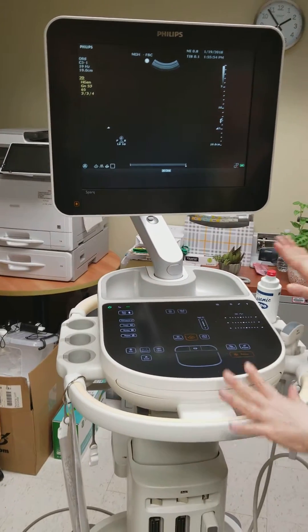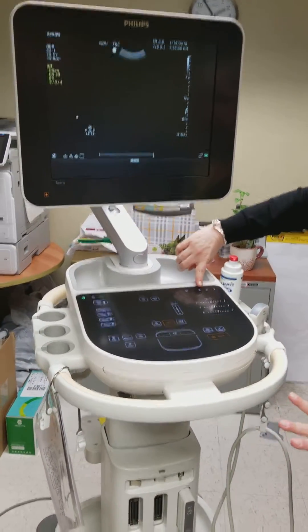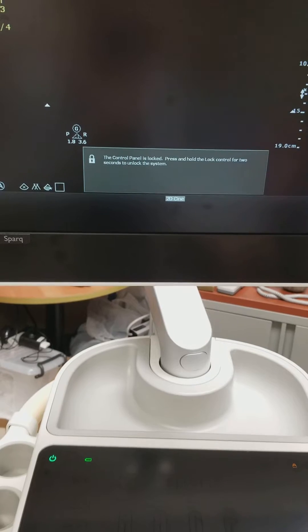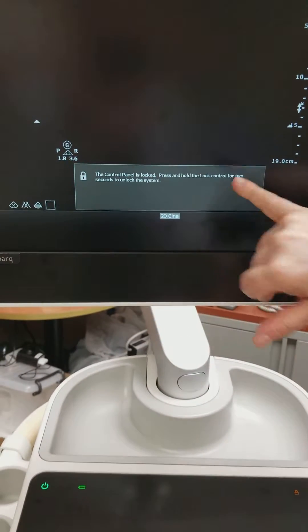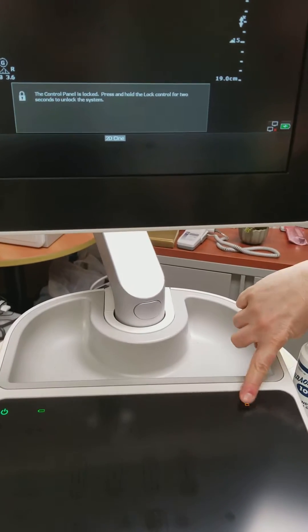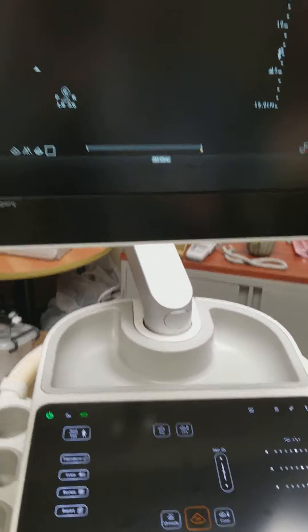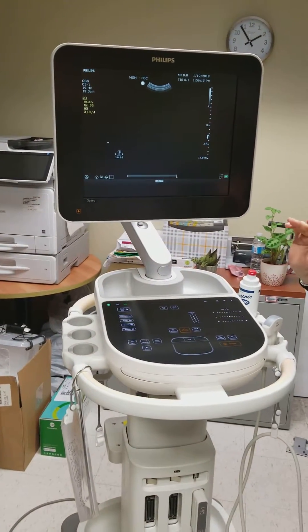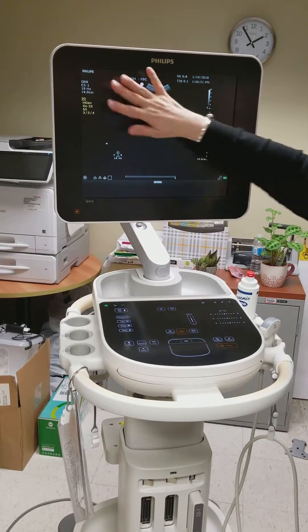If you need to clean this screen, we advise that you touch the lock button. Then you can clean it with the hydrogen peroxide wipes in the green canister. You'll also get a message that the keyboard is locked — just hold the button and it comes back. To clean the screen, as mentioned in last week's Friday file, just use a damp paper towel.